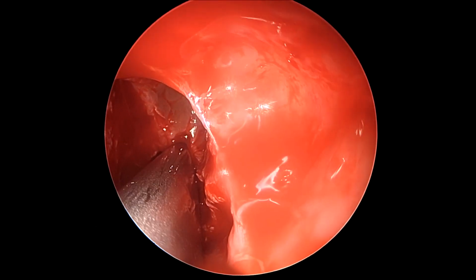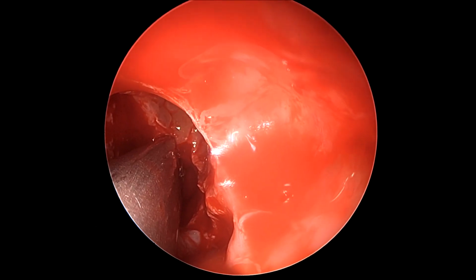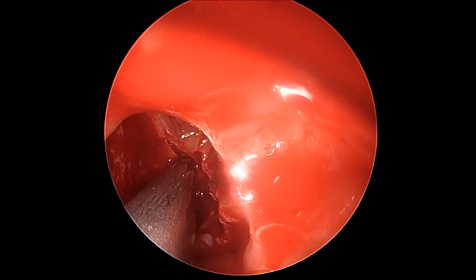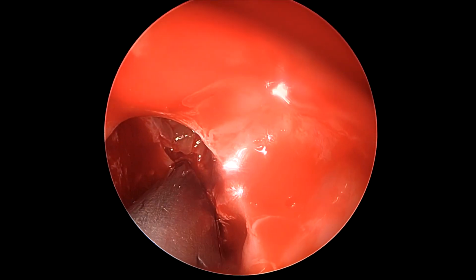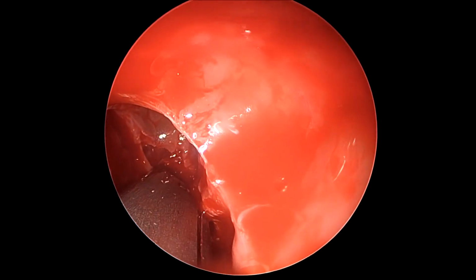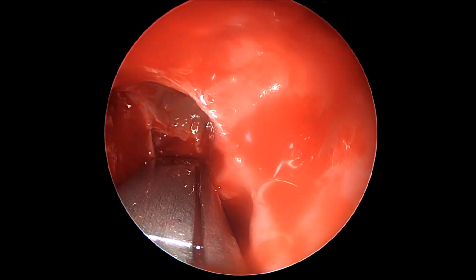So here we use the bone punch. We keep palpating the level, the amount of bone that is left to be removed, and we keep using the bone punch to remove more bone, to clear off the septation between the posterior ethmoid and the sphenoid sinus superiorly.